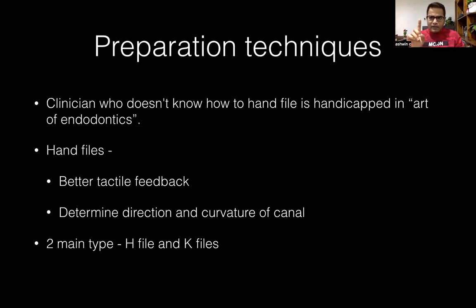Similarly, you are entering a completely blind canal with a blind view. You are entering a canal which is not known to you. So that's why you need to take the feel of the canal, and this feel, or better feedback, is given by the hand file.